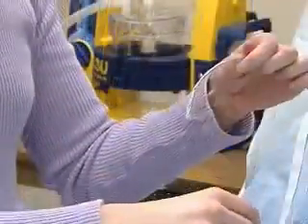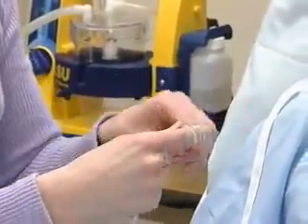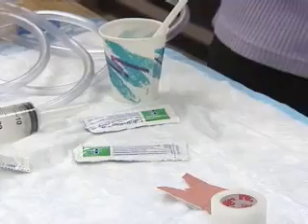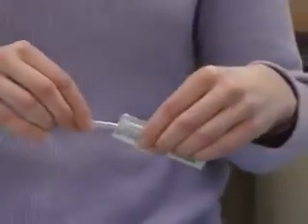We can create a gentle curve in the pliable tubing by winding 4 to 6 inches of tube tightly around the index finger. Then lubricate the end of the tube to be inserted — three or four inches should do.